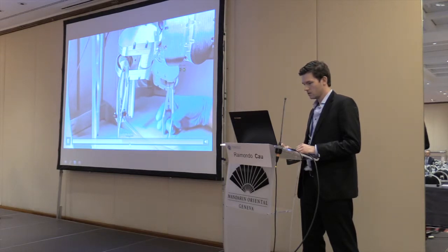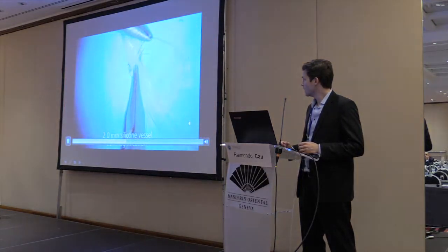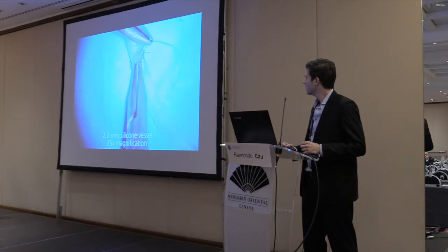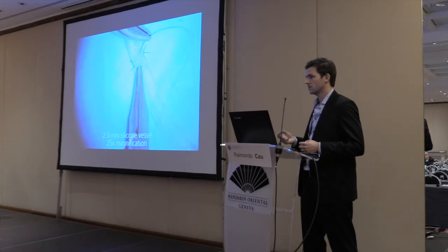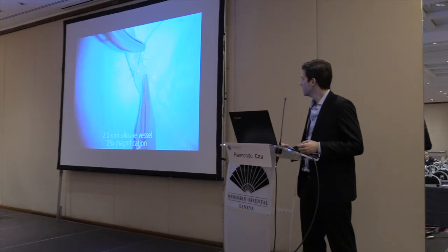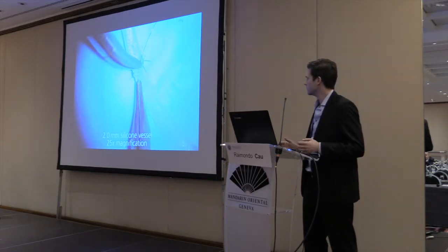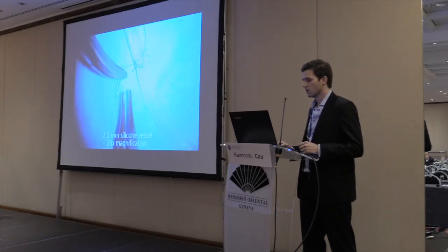And here you see how we have been performing anastomosis on the 2 mm silicone vessel. So this is a 25 times magnified view through the microscope. As Jesse already explained, normally you would see your hand tremor a lot. In this case, you see that it's really stabilized. What you do see is that it's still slower than the hand. So this video is not sped up or anything. This is the actual speed. And you see that it takes a little bit longer, and we're working on that.